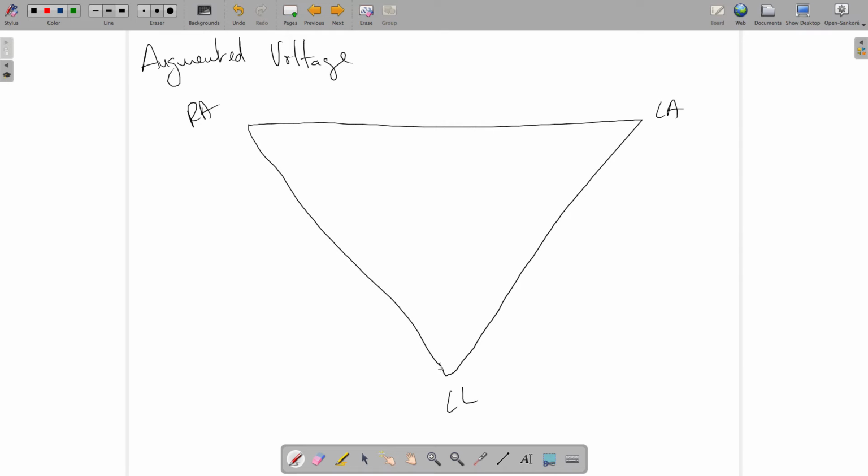Just as though you could use triangulation to find somebody in the woods by calling their name out, and then when they respond to you, whoever's closest moves a little bit closer, and you keep moving in on the target or the noise until you find the person, you're going to actually be able to use this same concept here. So your machine is going to do this.